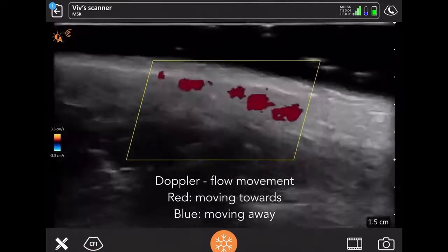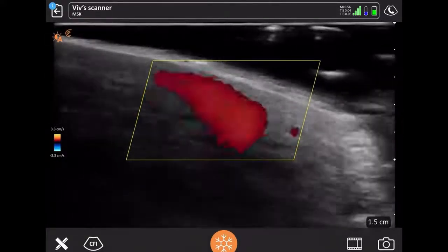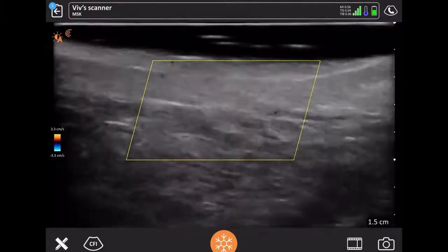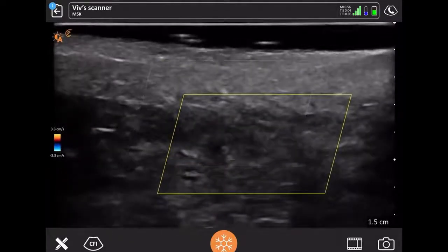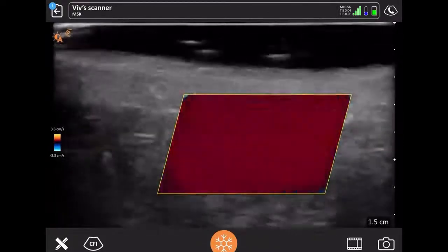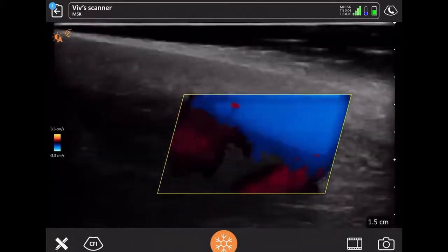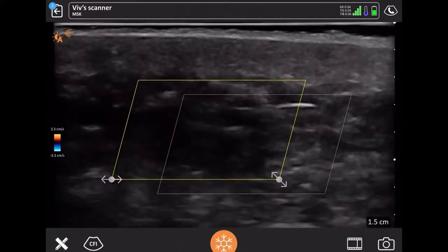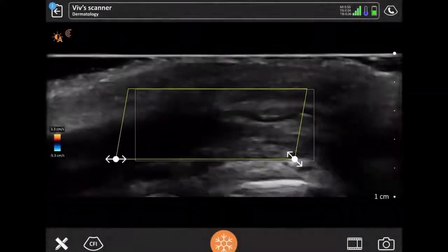So what I'm doing here is basically running the scanner along the area just above my mouth towards the nose to mouth area, and I moved it slowly. Lots of ultrasound gel on the skin, which helps with the detection of the tissue, and I'm gradually moving the scanner very gently and upwards, left and right, and in a few different directions. I've got a little yellow box on the screen there, which is a Doppler detector. It's basically showing blood flow, and I'll talk a little bit more about that in a bit.